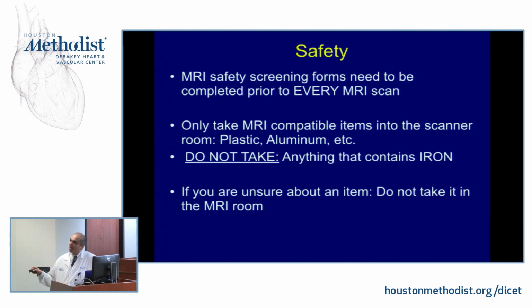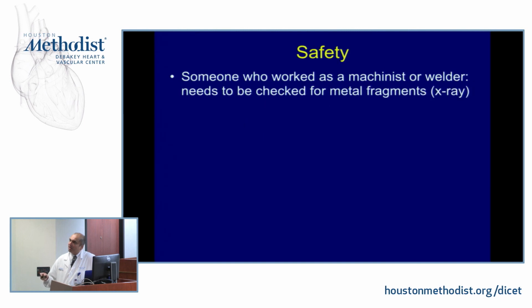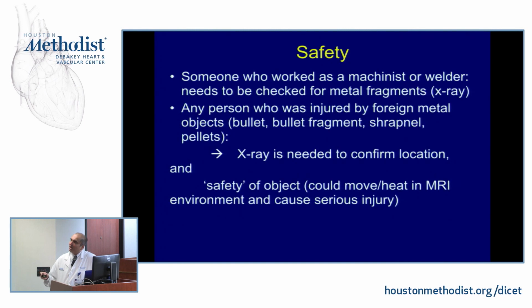Again, every patient has to get a safety screening, and it has to be done every single time they get scanned. So a patient gets scanned today, they come back tomorrow for additional imaging, we'll redo the safety form again. Because you don't know what could have happened between the time of the last scan and this time, and you don't want to take a chance. So we talked about the welding and grinding, and the need to get x-rays.